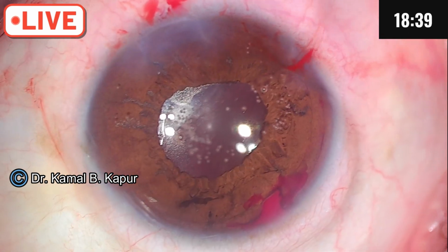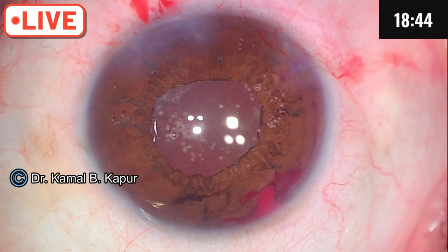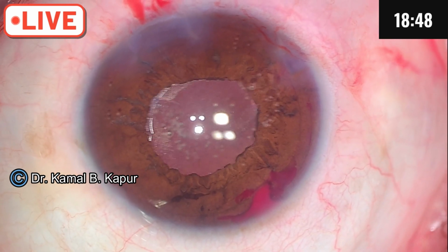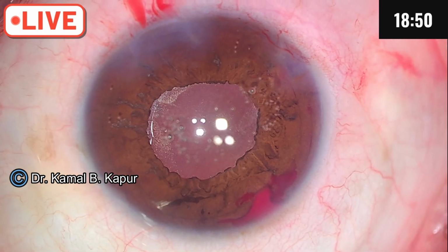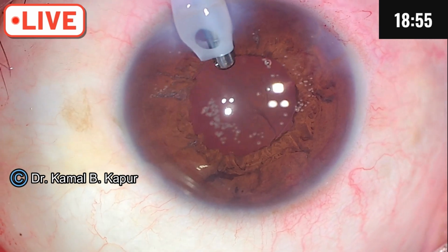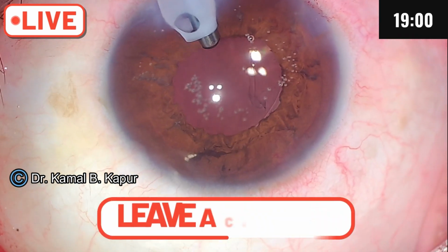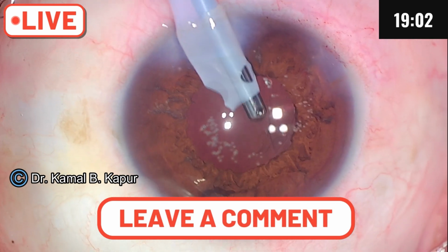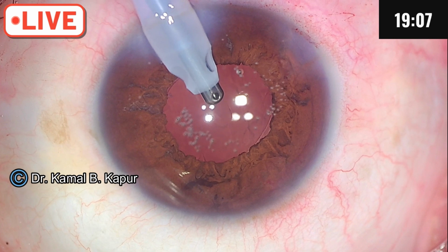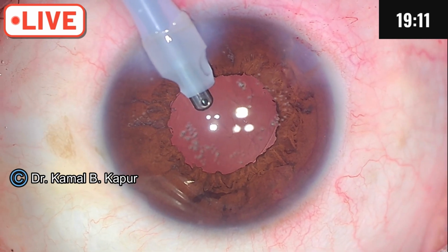So we just wait for some time, and when the ooze stops, we can wash the viscoelastic and finish the case. Thank you. The ooze has stopped. We will try and make the pupil round by slow nibbling and pulling on the iris. And then there we are, surgery being over.